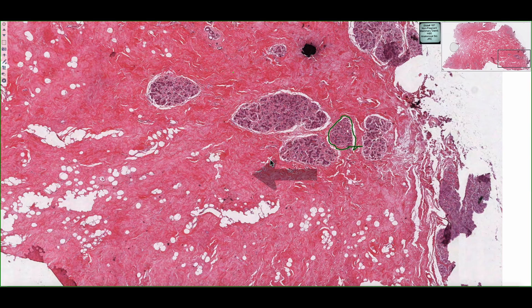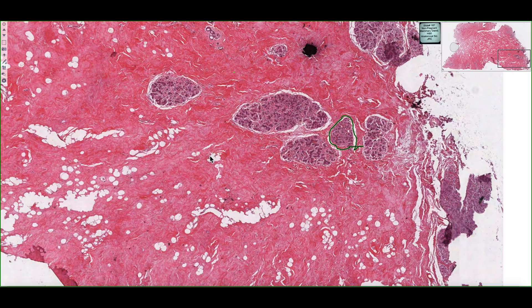This is a tissue section of an inactive mammary gland. We can see that it's characterized by a vast network of dense, irregular connective tissue. And within it, we can see patches of adipocytes or adipose tissue.